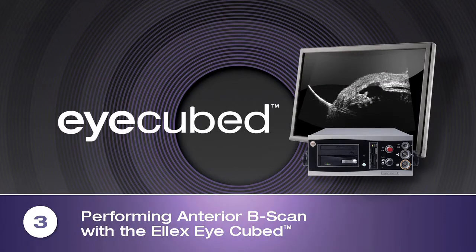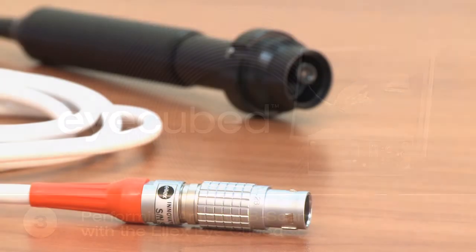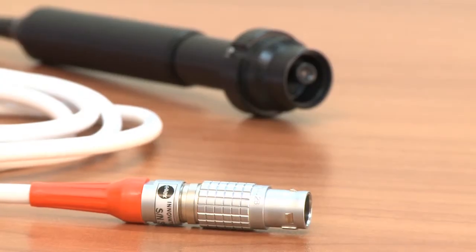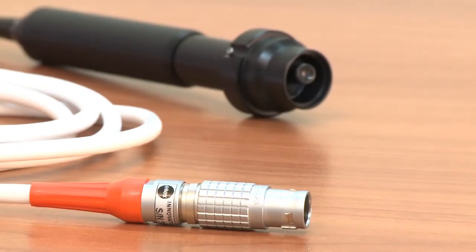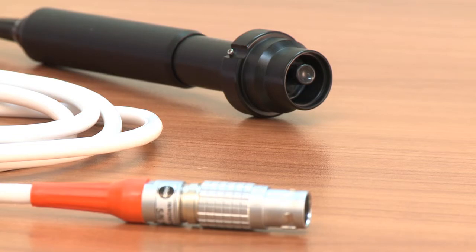Performing Anterior B-Scan with the LX iCubed. Performing high resolution 40 MHz B-Scan of the anterior segment with the LX iCubed is easy, fast and accurate.